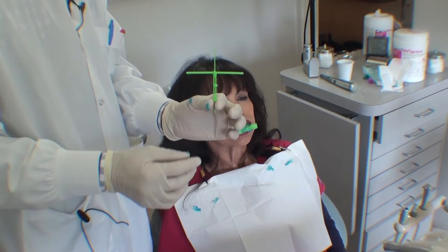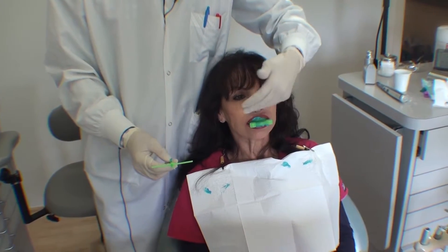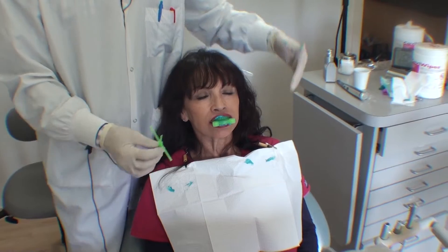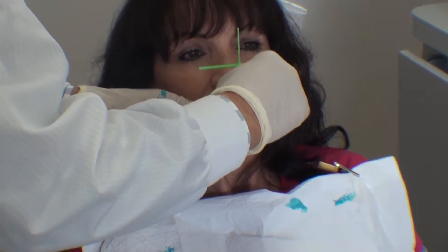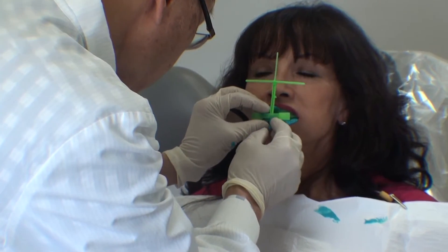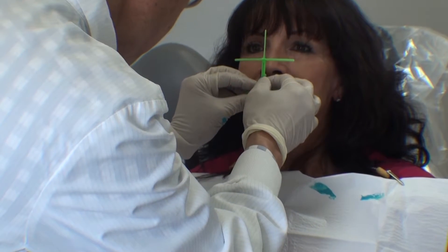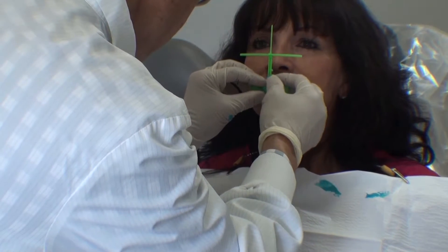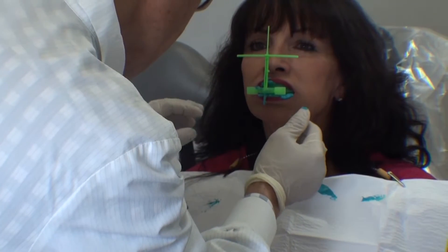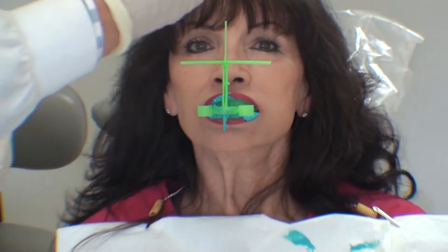Now you want to position this cross to be in line with the midline of the face and the proper occlusal plane. You should stand in front of the patient so that it's properly aligned both in the vertical plane as well as the horizontal plane.